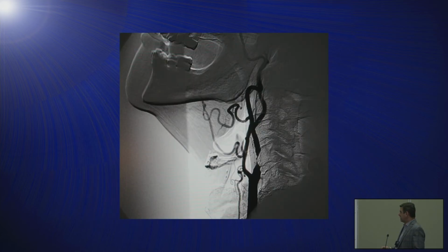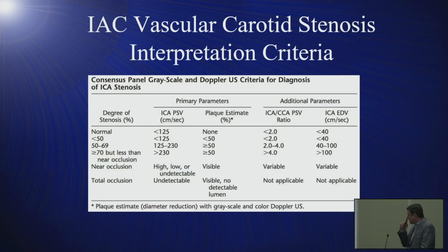You know, I think when we're looking at lesions like this and talking about carotid disease, if we're doing an eversion endarterectomy, you need to know that. If you're doing a patch, you need to know what the operating report says. If there's TCAR, you got to be worried about the access site, which is down here. So you're basically doing your general survey as you normally would your arterial system. The criteria is still basically about the same. You're still doing the same criteria that we have used, historically.